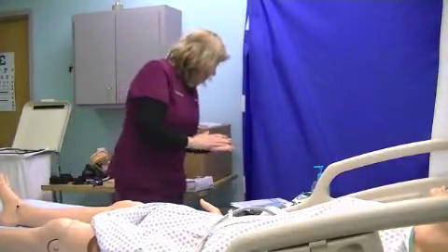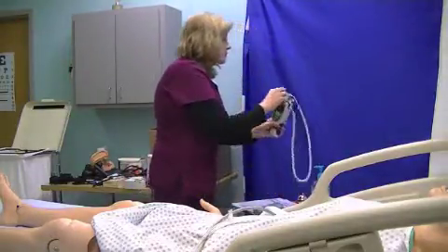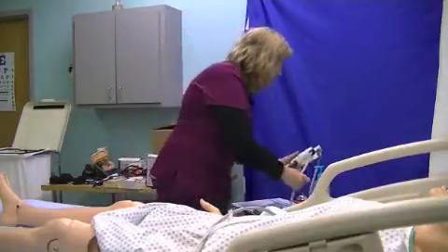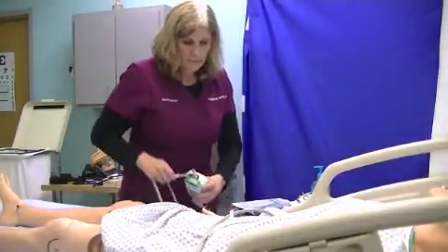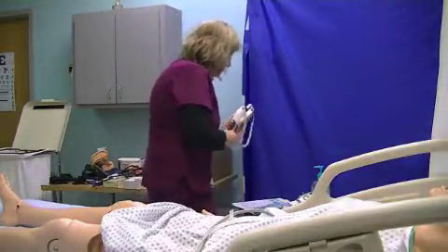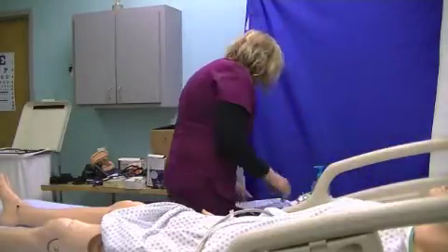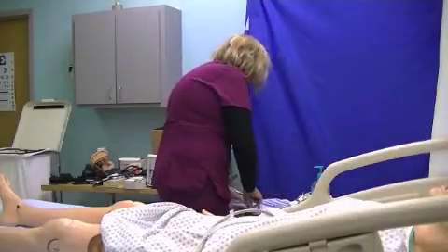I want to make sure I remove gloves and wash my hands. Now I'm going to make sure I clean the thermometer with the alcohol pad to make sure it's all nice and clean, both of them, the ones that I used. And we're going to put it in a charger, because a lot of them charge.